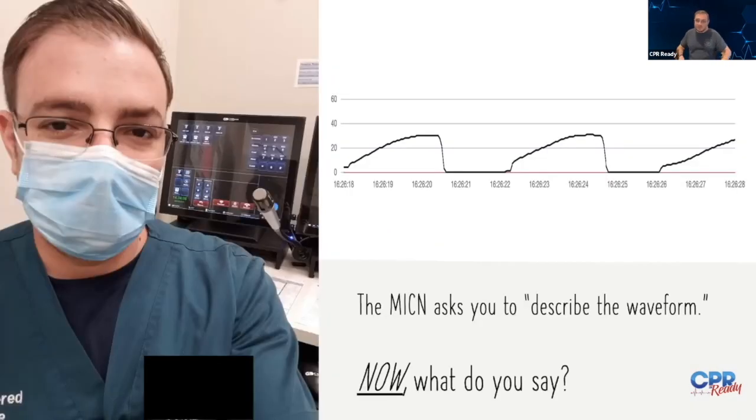All right, so back to this one. So you're asked to describe this waveform. Based on everything we've talked about, how would you describe this, and what does it mean? And you can throw it in the chat. Okay, shark fin. And what does it represent? You have somebody who's in respiratory distress. You see this shark fin. What's the most likely cause for it? Asthma, pneumonia. There we go. Asthma or COPD.